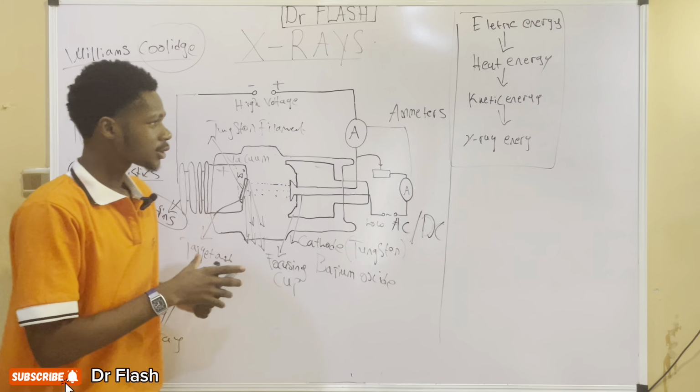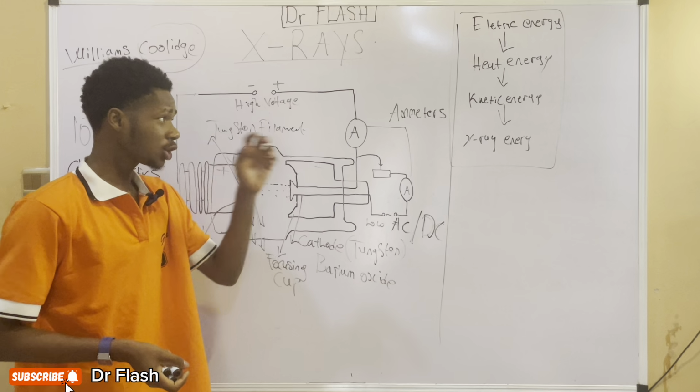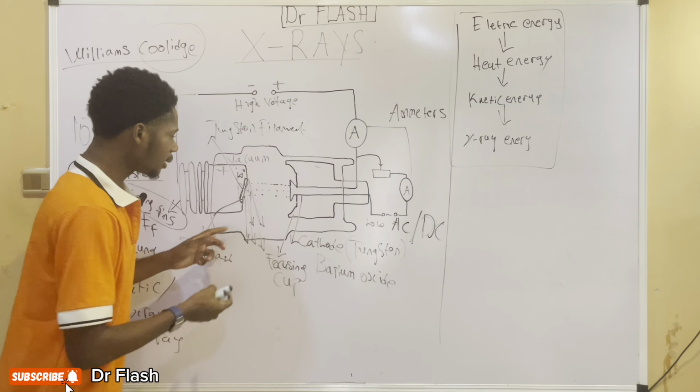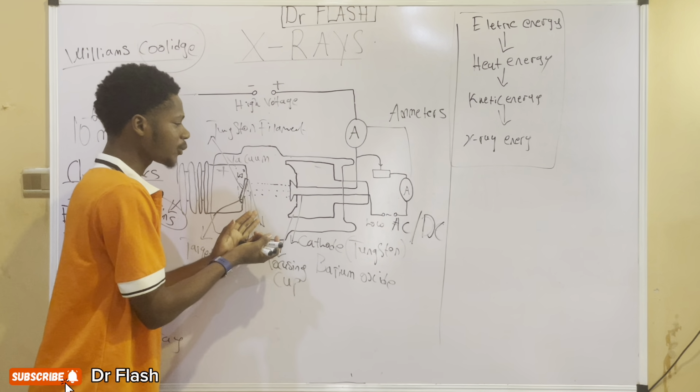Now how about the two kinds of X-ray, the hard or the soft X-ray? We just talked about the energy. Some X-rays have very, very high energy. That is why we embed this system in a lead chamber.